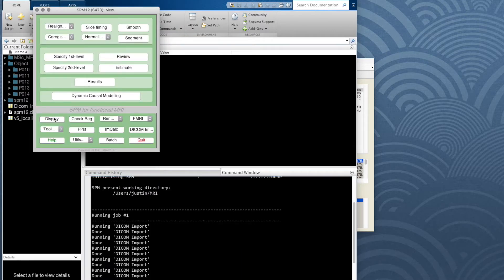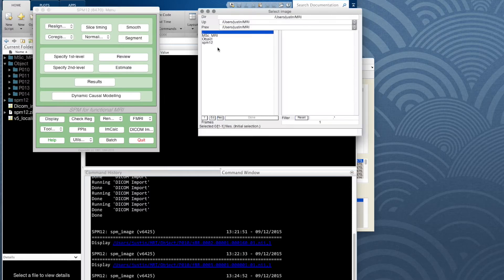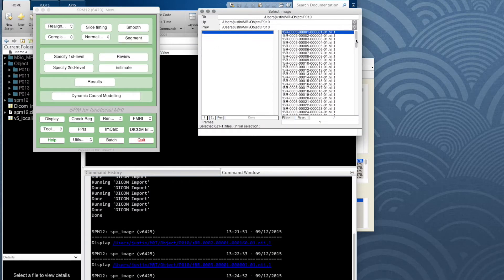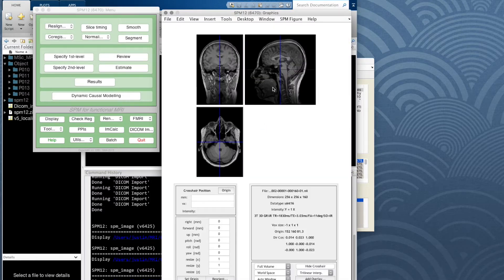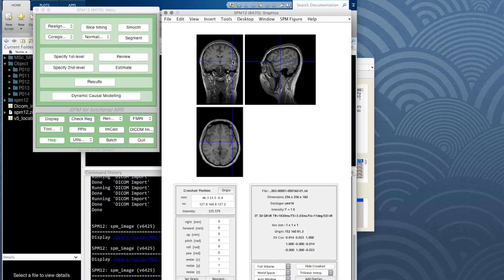Use the SPM display function to have a look at those images and check the structural is okay. It looks good and there's nice contrast between the gray and the white matter. There's another video where I go through all the options in the display and what all the information means, so check that out because it does lots of useful stuff, including adding statistical data later if we need to.